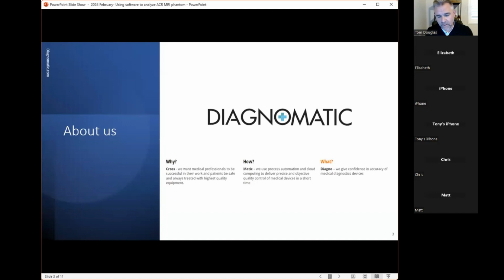So just briefly, probably a lot of you are familiar with our company. Diagnomatic is the rebranding of ProProject. Diagnomatic is not just the name of the software. We're putting that name on our phantoms as well. It's a combination of diagnostics and automatic.